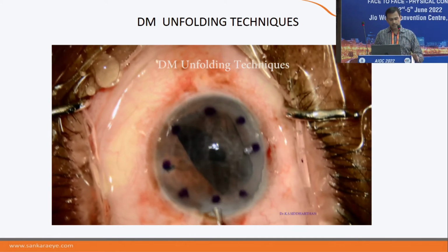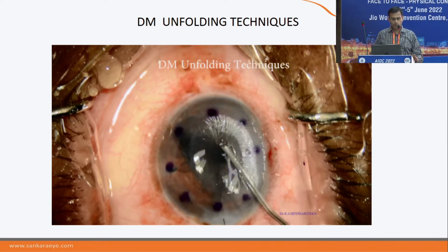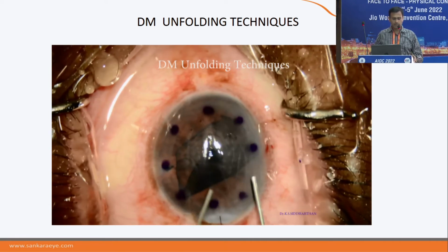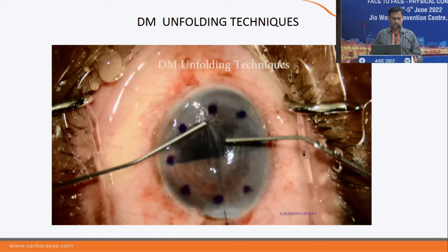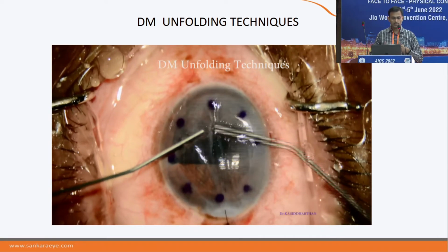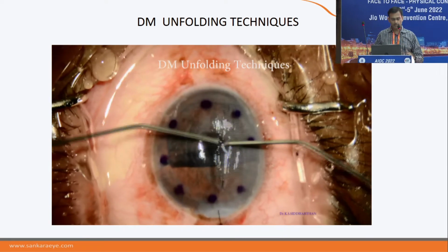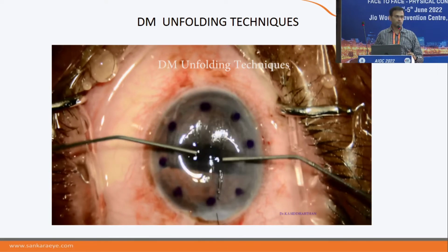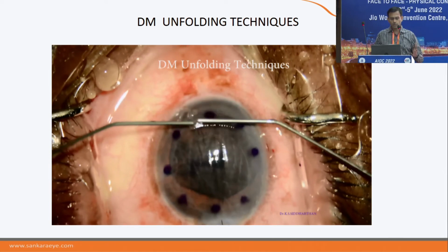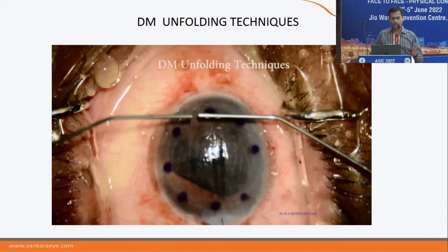And the second phase was when we used to have two hydro needles. You can inject a little bit of saline, and you can do like this. You're seeing how Vikas was showing, it was just the same way. You keep tapping with both hands and you try to unfold. So this was the second type. We didn't want to tap too much. We just wanted to do a little bit of very gentle tapping and unscrolling.